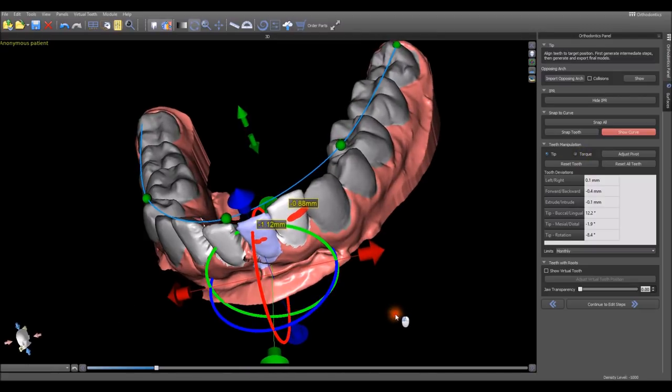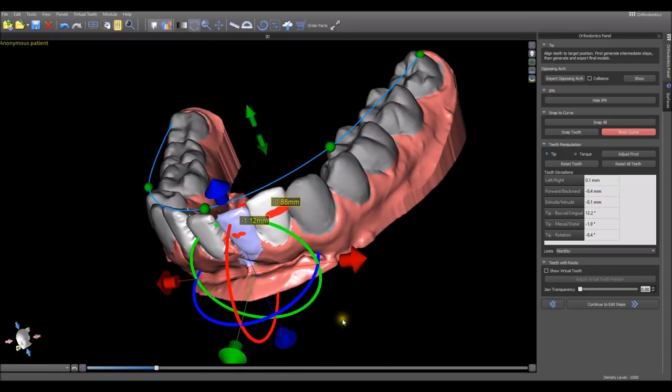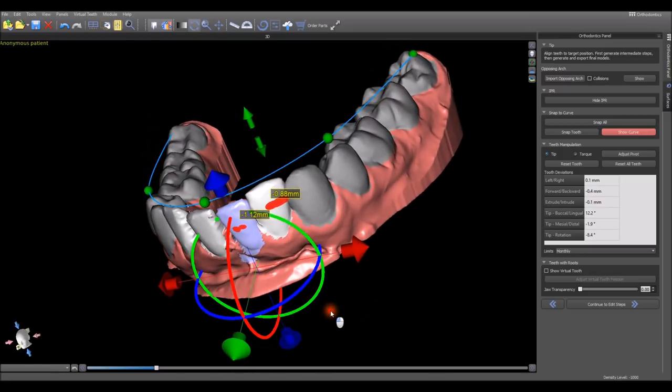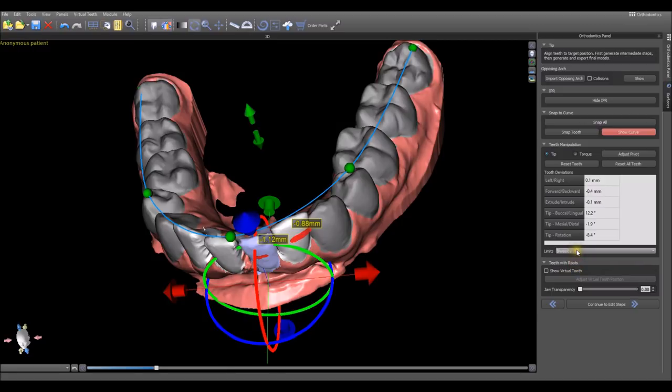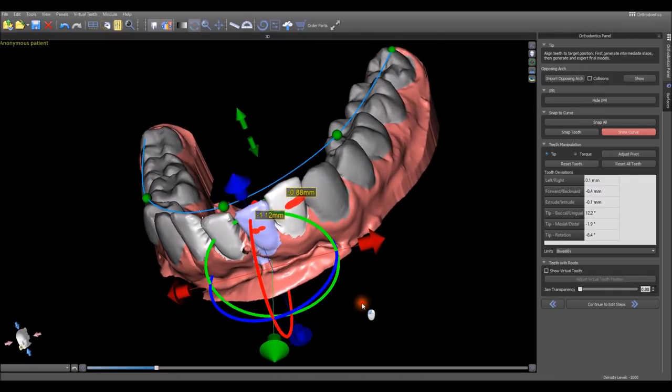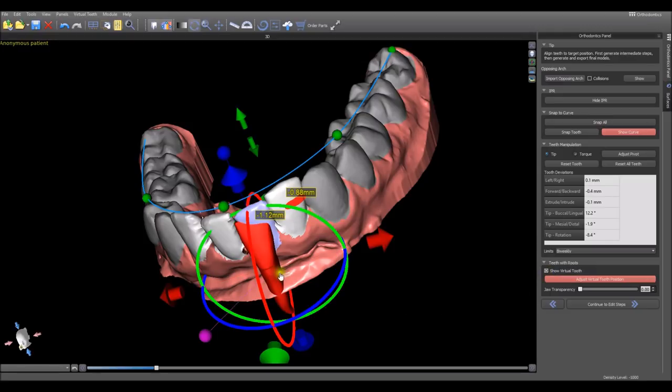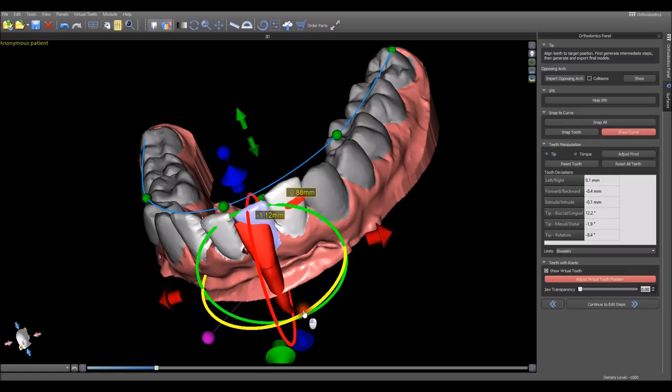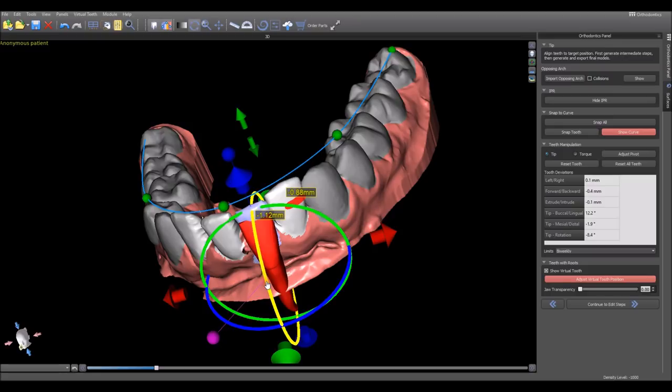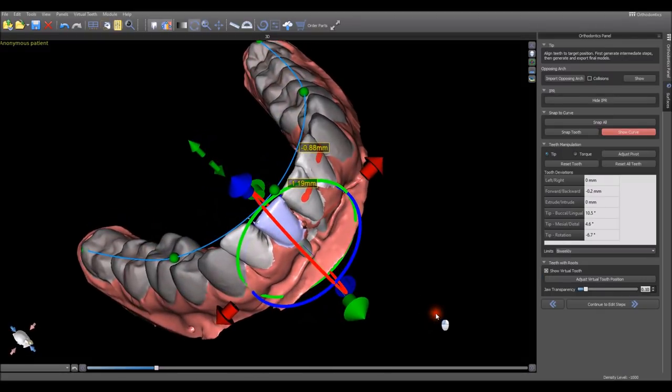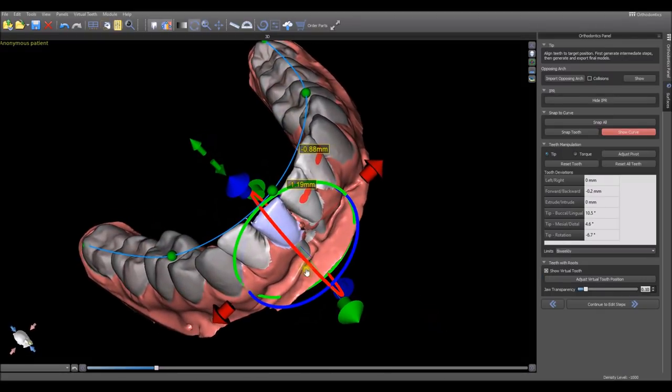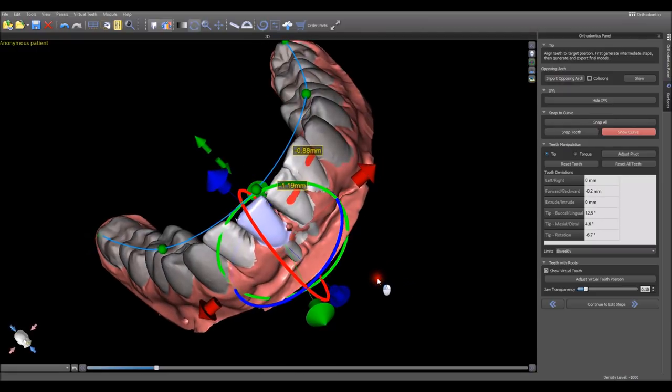The software is going to be creating the incremental model steps for the liners. Here you can select if you want the steps to be based on monthly, bi-weekly, or weekly calculations and the software will adjust automatically. We've also added the ability to add a virtual tooth. When you click this, you can see a virtual tooth is placed close to the tooth and you can use the widget to fine tune the placement. This allows us to rotate the teeth and see how it affects the approximate root position.